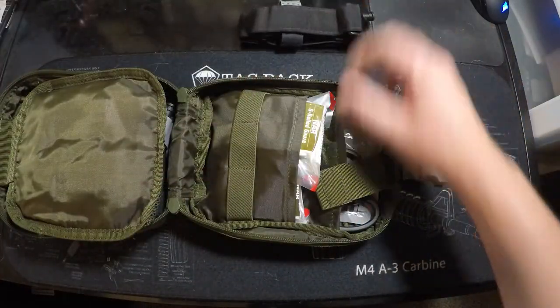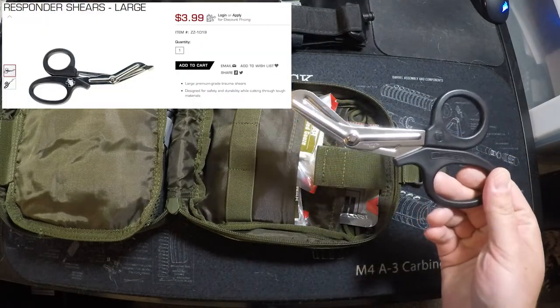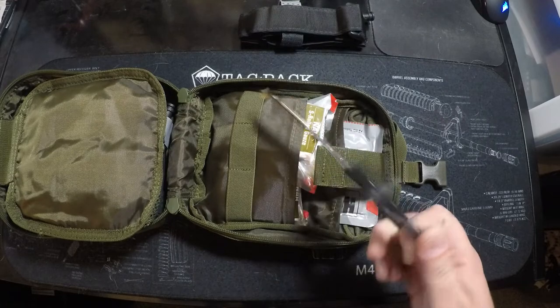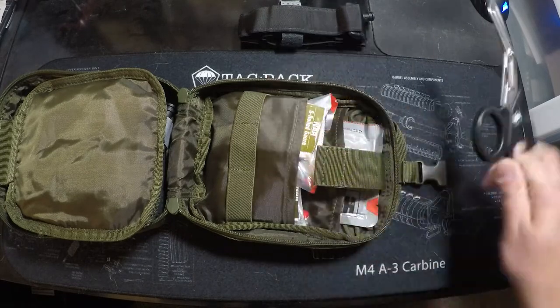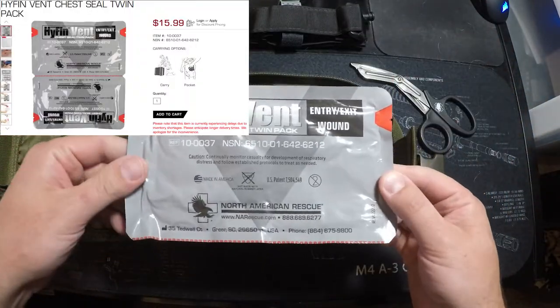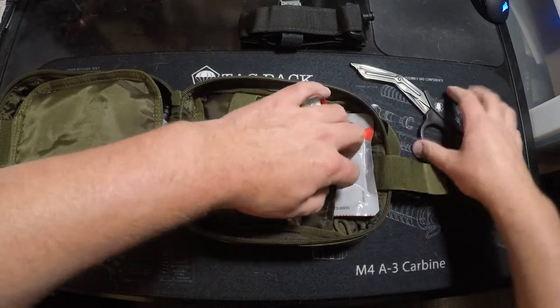I also have trauma shears up top — these ones are super cheap, about four bucks. I've watched some stuff on YouTube and these things are really only good for one person's clothing, but I have two pairs. I also have a set of chest seals — I bought the larger ones and will pick up a set of the compact ones soon. Chest seals are very important for chest wounds.